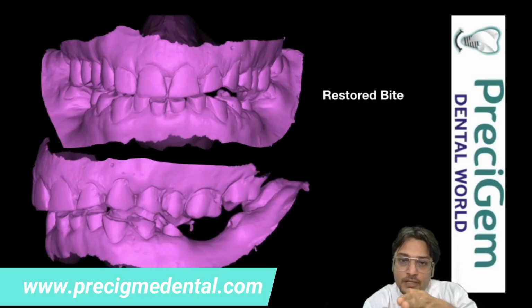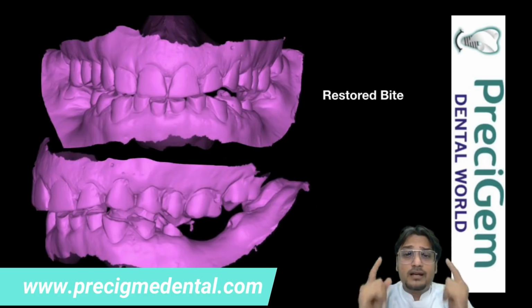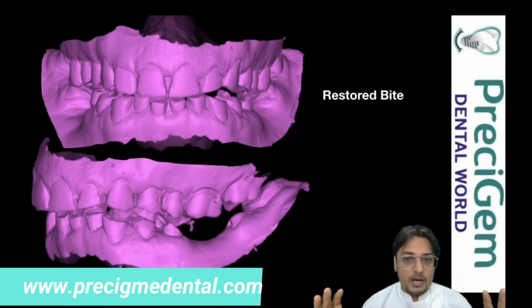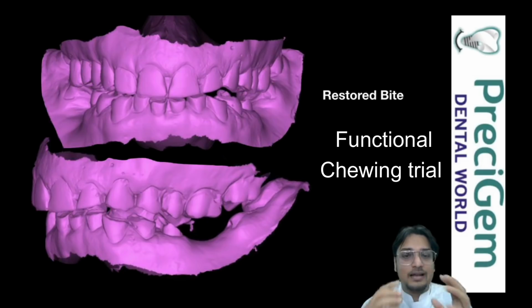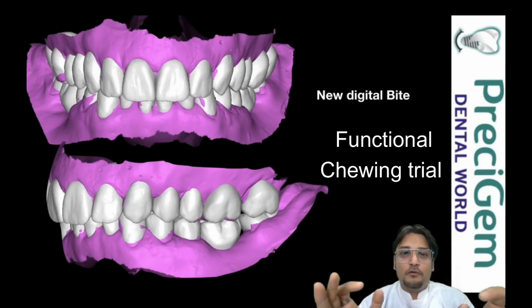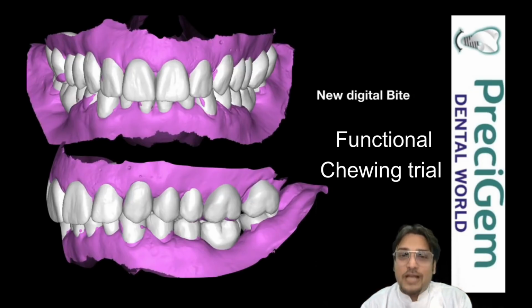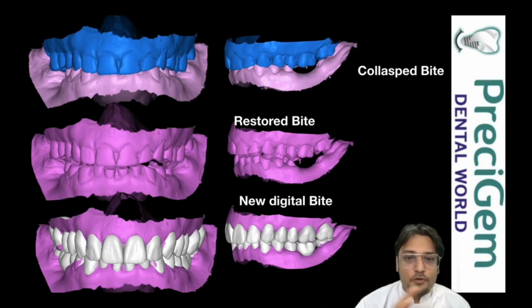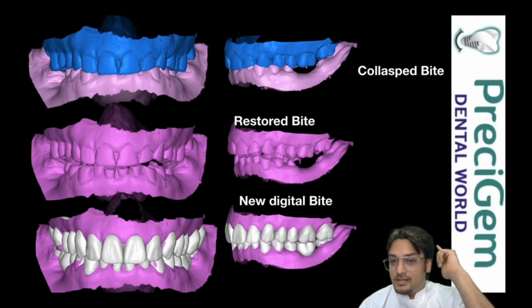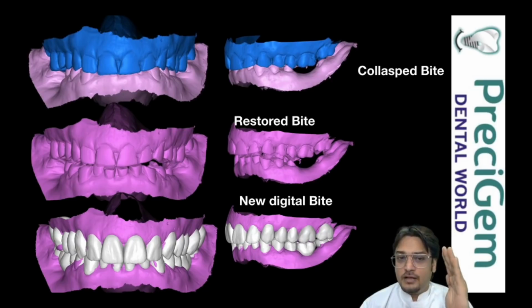Restored means we have opened the bite. Now this is opening the bite, respecting your muscle harmony. It's not just opening randomly. We respect your muscle position, and according to that your teeth are opened. In this open bite, we design your teeth in such a way that it accommodates, and now your new teeth will accommodate this new bite. So that's how we restore your collapsed bite or your collapsed facial height into a newly designed bite. If you can see the differences: collapsed bite, restored bite and new digital bite. There is a front and right side, you can see it very clearly. Now you get much difference.